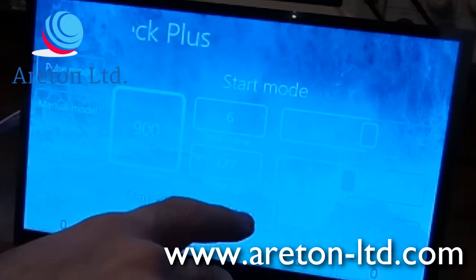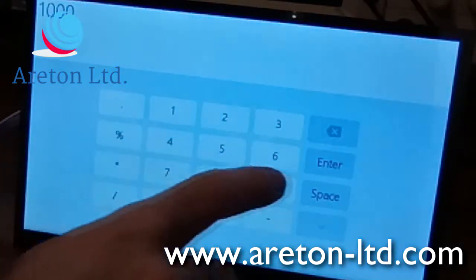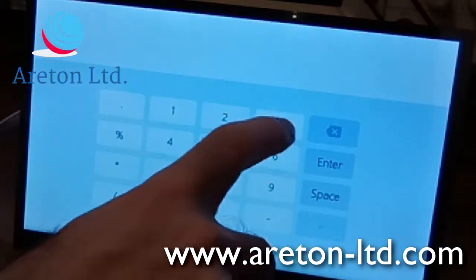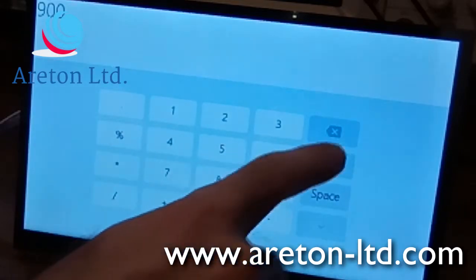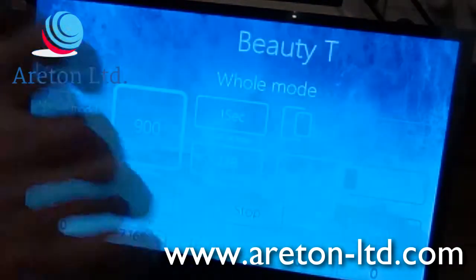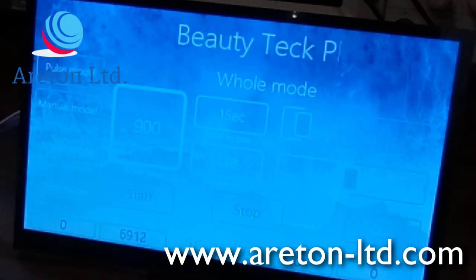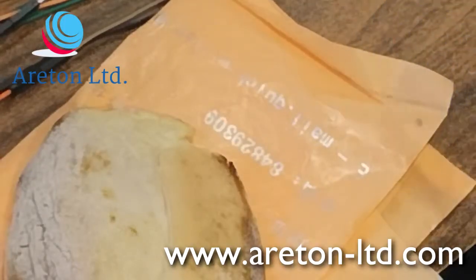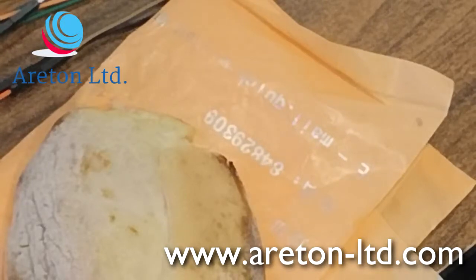So I'm going to go into the hold counter mode. I'm going to set it to 900 milliseconds, as I showed you in the video. 900, enter. And the device has been set up. The noise that you're hearing is that the device thinks that there's been an arc being produced. So I'm going to start the setup process again.